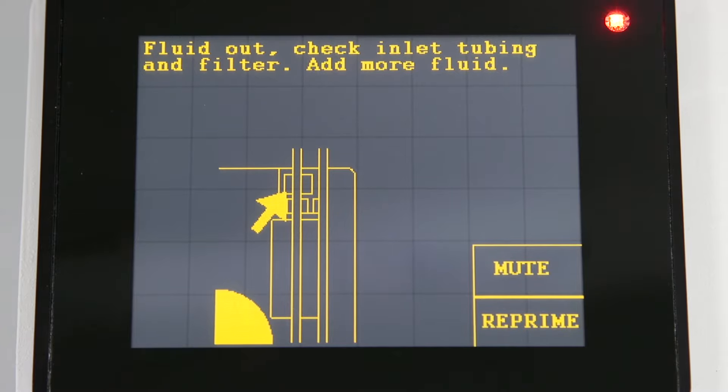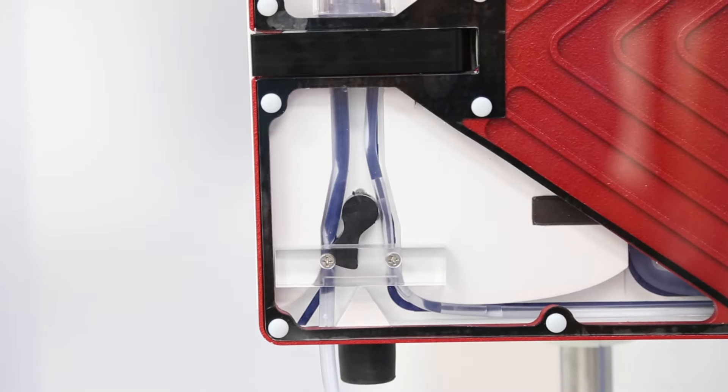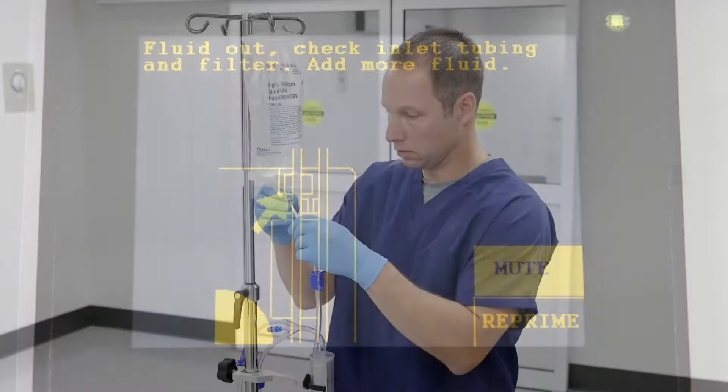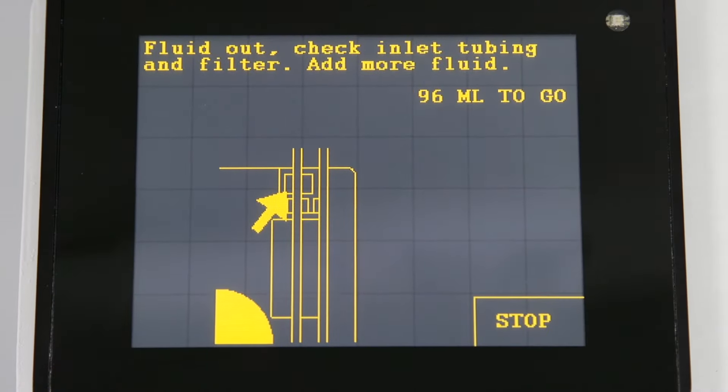A fluid out alarm will occur if the operator allows the system to run out of fluid. The Belmont will immediately stop infusion and automatically clamp off the patient line. Press mute to silence the alarm, add fluids, and press reprime. The system will automatically reprime in 13 seconds.